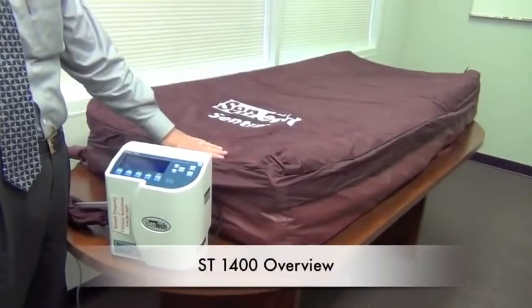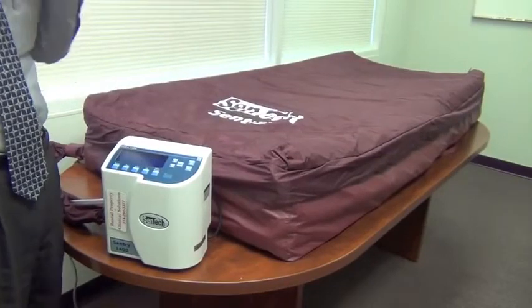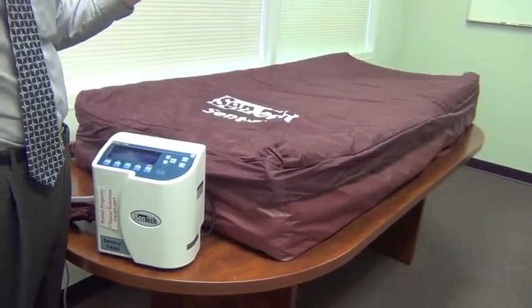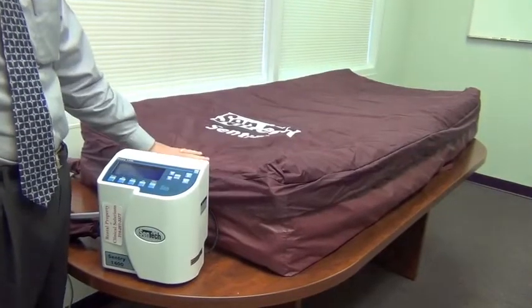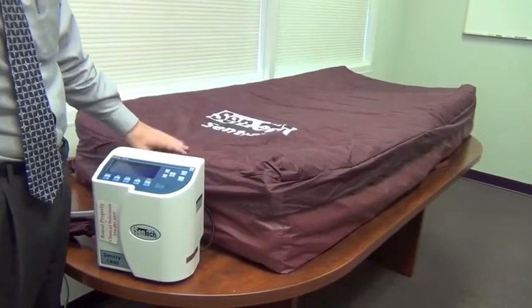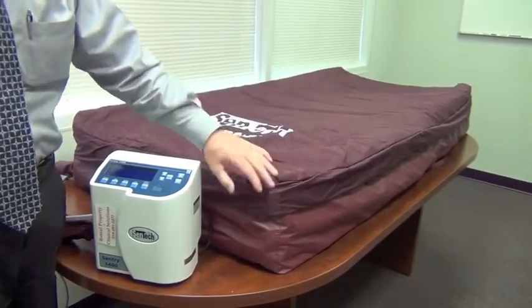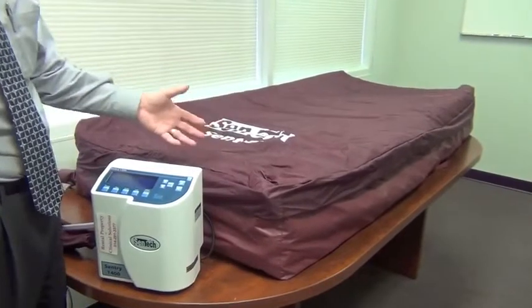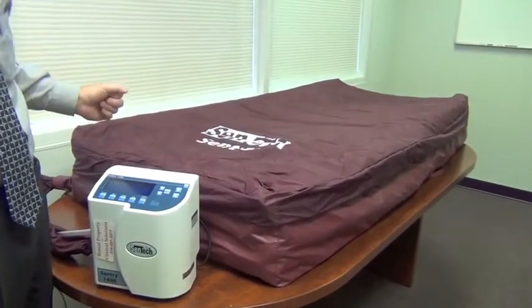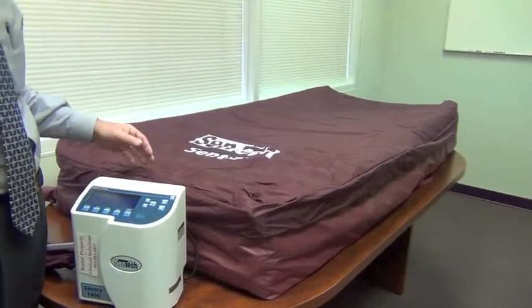This is a mattress replacement on the Sentry 1400. It replaces the hospital mattress. So when this is put into service, the mattress on the hospital bed is removed. This is never placed on top of an existing mattress. When the mattress is removed and this is placed on the pan of the bed, it's secured to the bed frame on either side with tie downs, which are also at the head and foot of the mattress. If there's a place to secure it there, we recommend doing that as well.